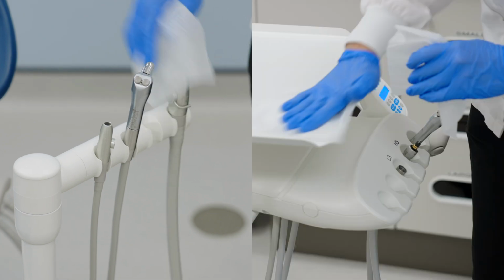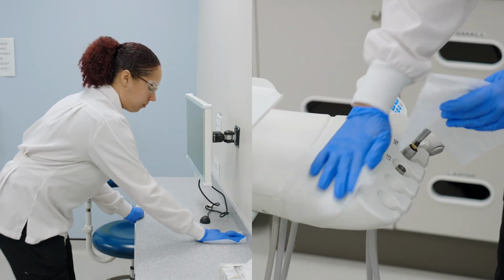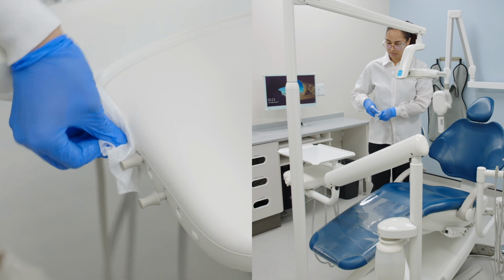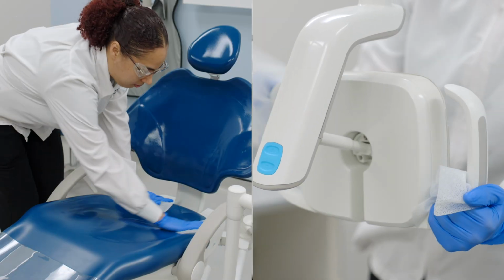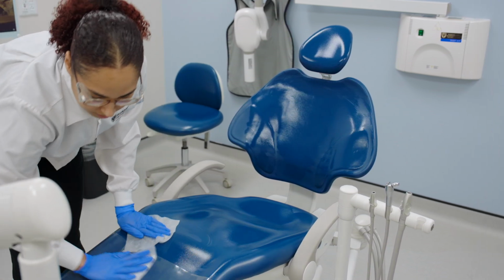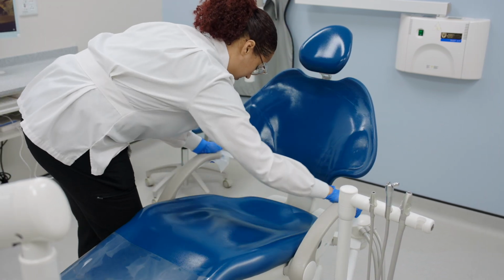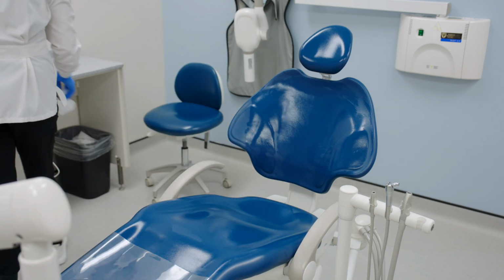Bracket table and handles. Control unit surface, switches, and touchpad. Countertops, evacuation hoses, air water syringe, hanger arm, handpiece tubing, and hanger. Dental light and handles. Allow for 2 minutes contact time. This is the amount of time it takes for the disinfectant to work.